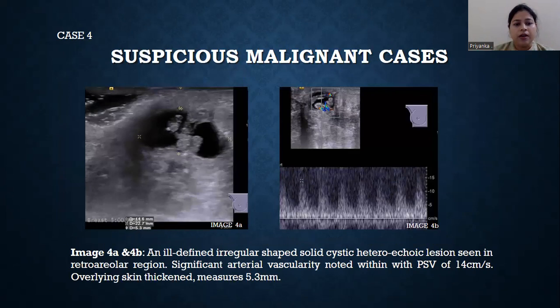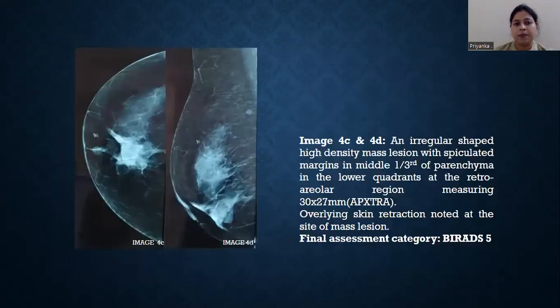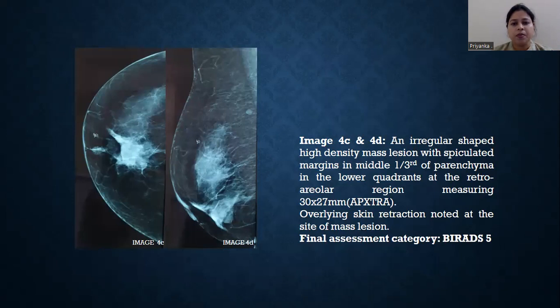Case number 4: an ill-defined, irregular-shaped, solid-cystic, heteroechoic lesion is seen in the retroareolar region, with significant vascularity on limited color Doppler and overlying skin thickening. On mammogram, this lesion was seen as an irregular-shaped, high-density mass lesion with spiculated margin and overlying skin retraction. It was given BI-RADS 5.